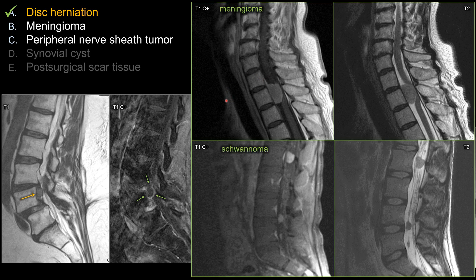These are examples of meningioma and schwannoma. For the meningioma on top, you can see a dural tail — it's an intradural extramedullary lesion causing cord compression. There's also a schwannoma, also an intradural extramedullary lesion. Notice that both lesions enhance relatively homogeneously and centrally, not with peripheral enhancement like a disc.